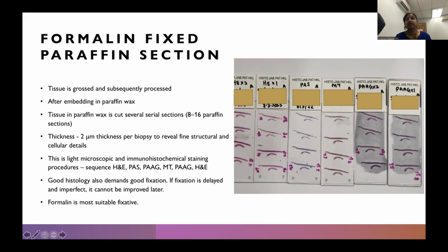These slides are taken in a photo where they're not according to the exact sequence. Just forget about this. I'm just showing you the images here. They are done in such a manner so that whatever lesions that you see, when they come back again, you get to see it in a different color or a different stain. So that would benefit us in identifying the lesions.